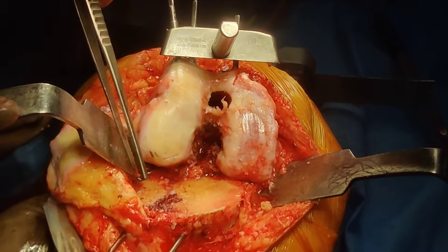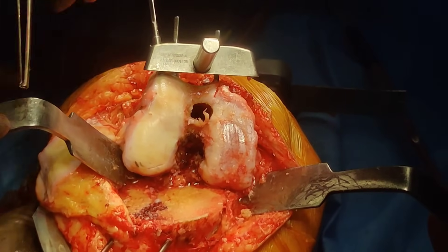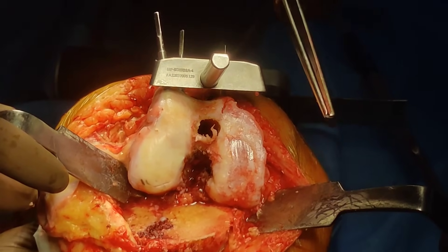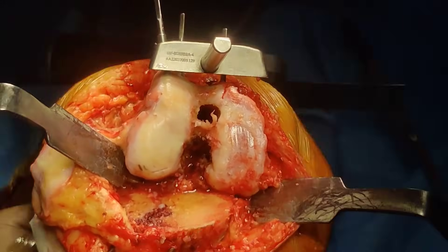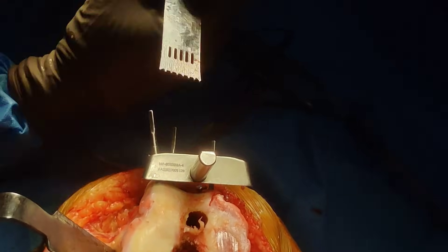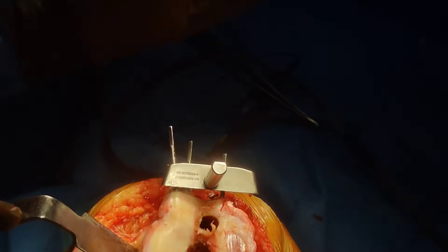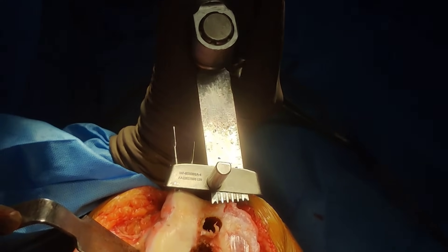We have done the proximal tibial cut and are now ready for the distal femur. Again we are not going into sizing here, but we are ready for the cut. You need two retractors — one protecting the lateral structures, one protecting the MCL and medial structures. Again, you can cut with the saw forward or upside down. If you go forward there is a good chance you will dig in, so again go upside down with your hand resting on the patient, starting from one side at full speed.